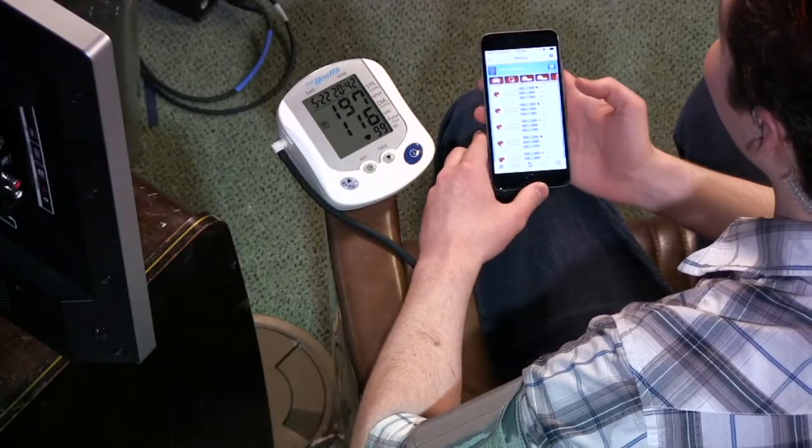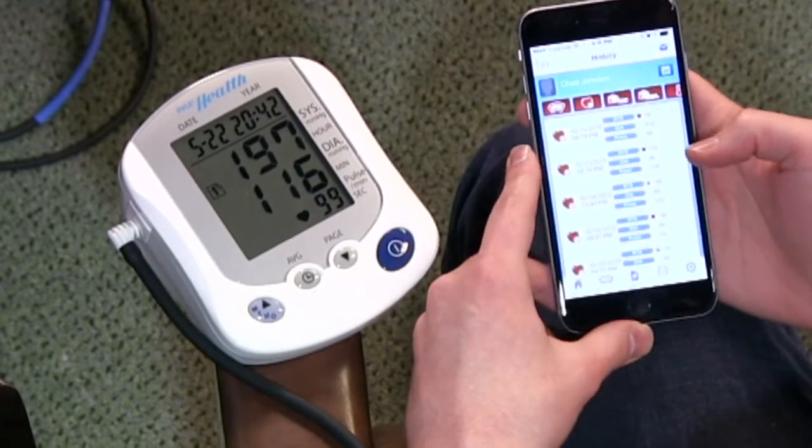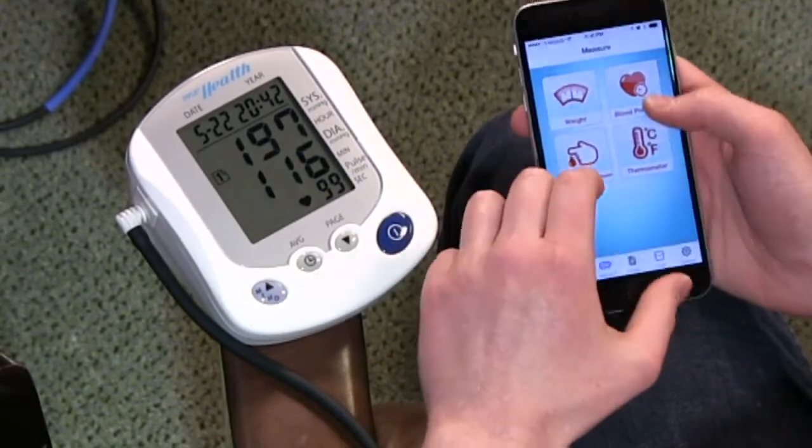You can see it gives you a history. I think if this were not television, we'd probably send you to the hospital right now. Probably say, what are you doing? But because it's television, you have a license to die. That would be interesting television, wouldn't it?